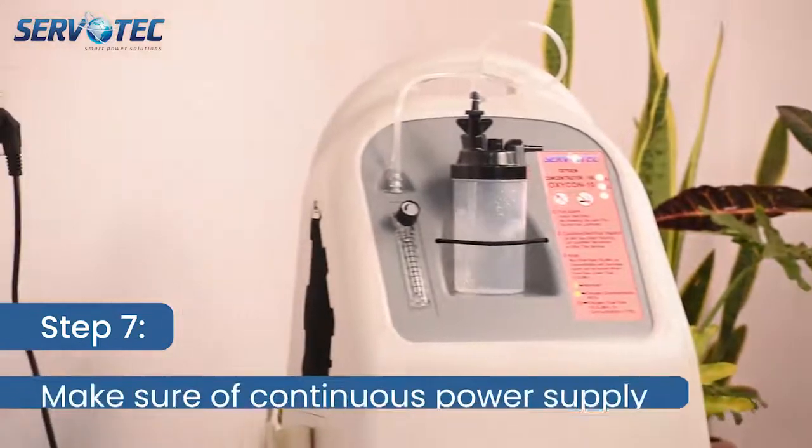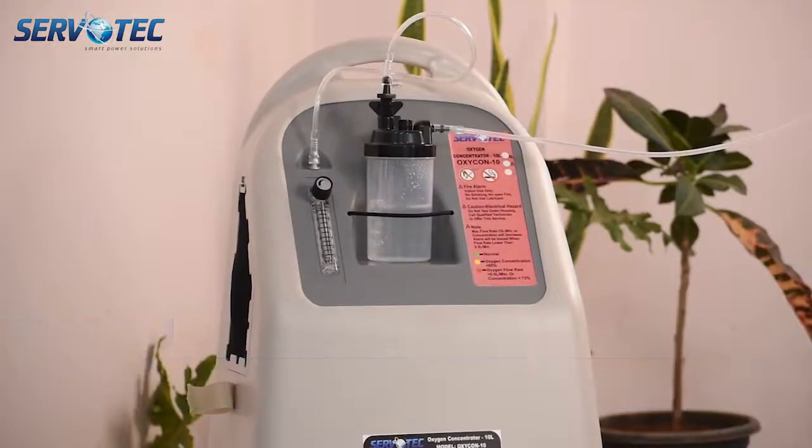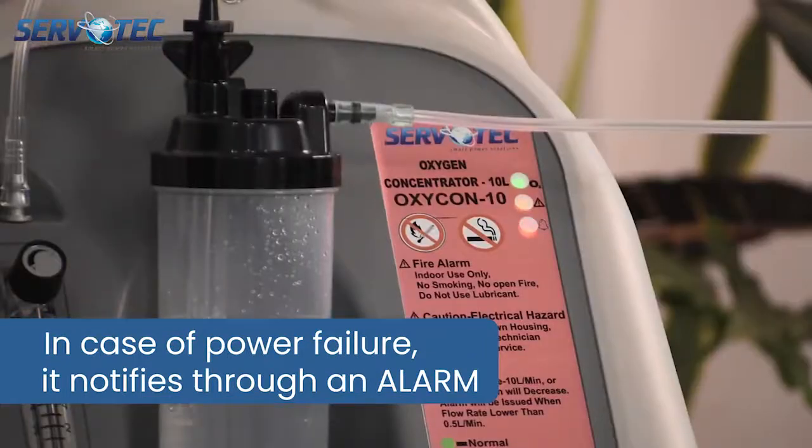Step 7. Make sure the oxygen concentrator is connected to a continuous power source. In case of power failure, it notifies through an alarm.